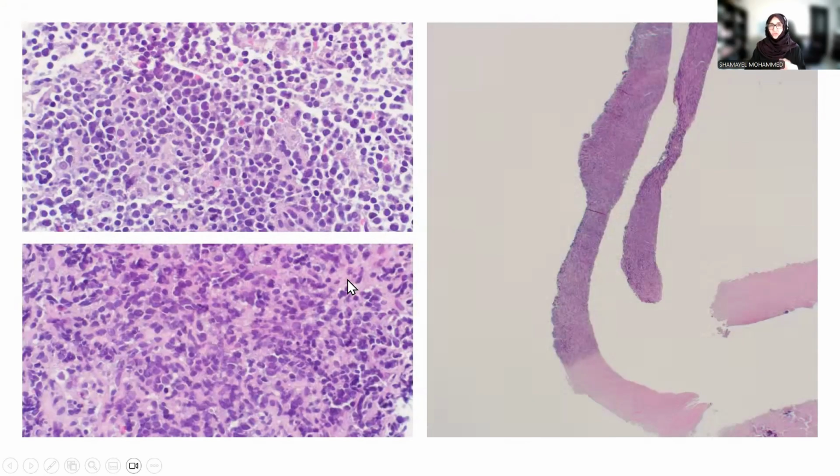So this is a patient who is known to have follicular lymphoma and has been treated, now presents with generalized lymphadenopathy and an aggressive course with B symptoms. Lymph node biopsy, as you can see, this is the needle core biopsy. Even though they are small cores, you have here some extensive necrosis, and the high power view shows sheets of lymphoid cells with high N/C ratio and almost blasty, fine chromatin, and crushing artifact.